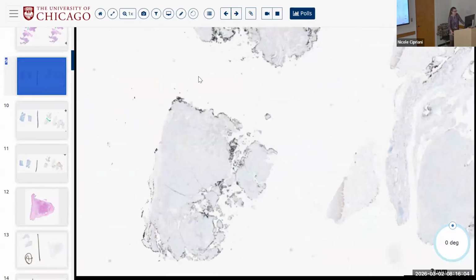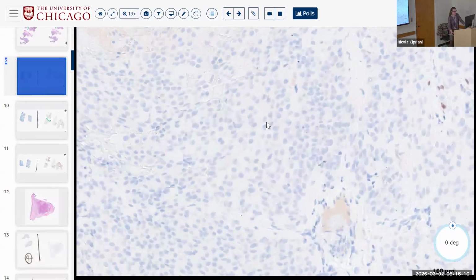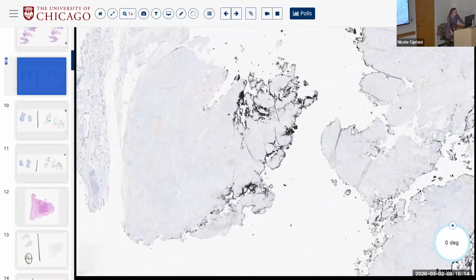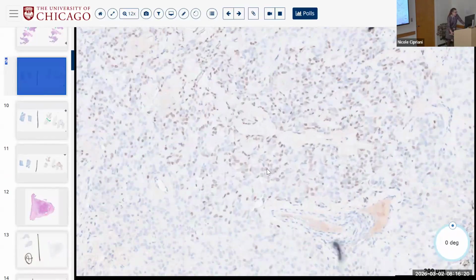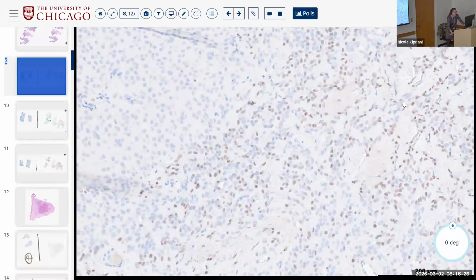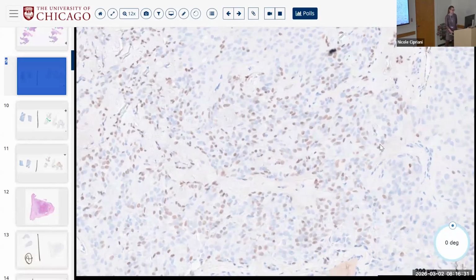And when we come over here, well, most of those hyaline or plasmacytoid myoepithelial cells don't have P40, but that is not uncommon. So we want to look for areas that might have P40. Aha. Okay. Does this P40 to you seem random, or does it seem like maybe there's a geographic distribution?